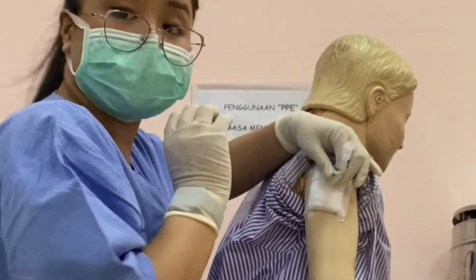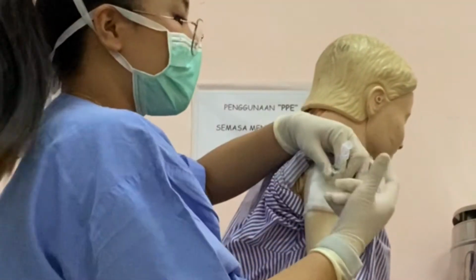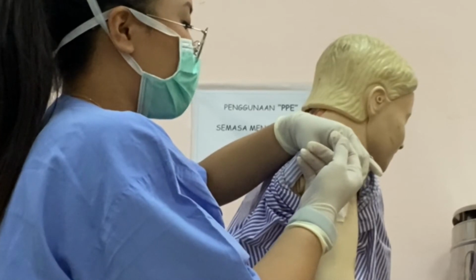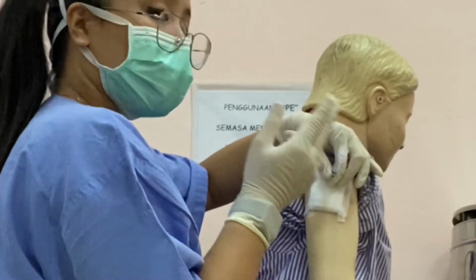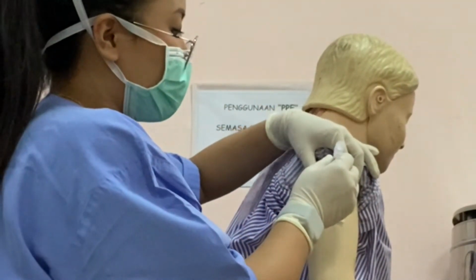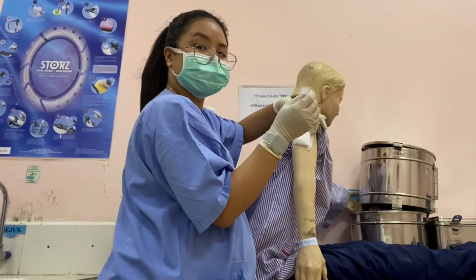But if there is none, then the medication can be injected. Carefully, slowly, and then wait for 1 to 2 seconds. Then you can withdraw the needle.